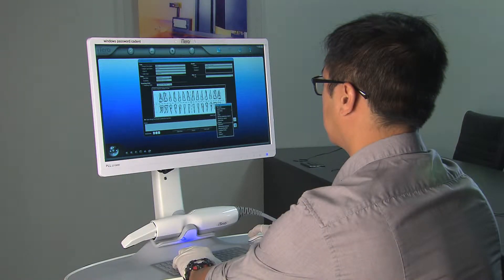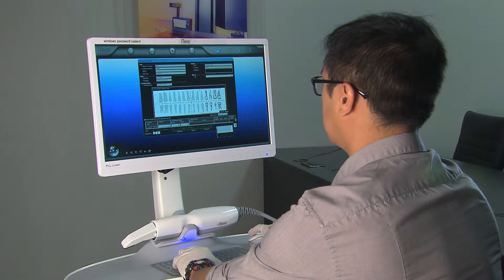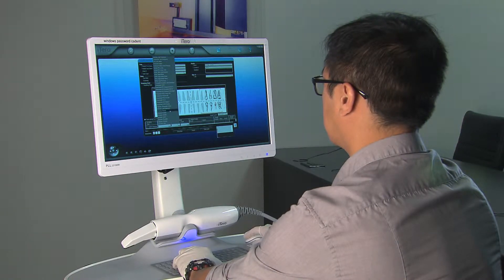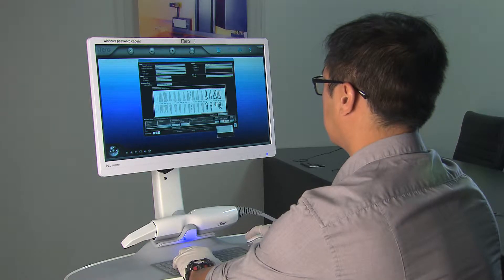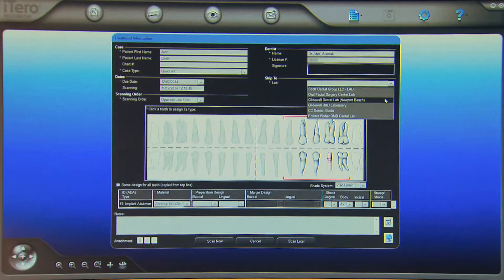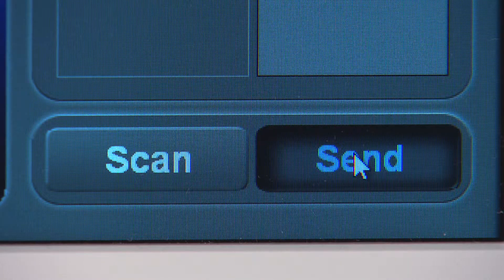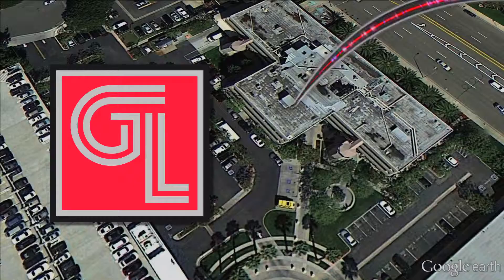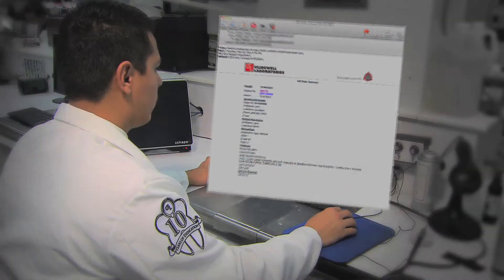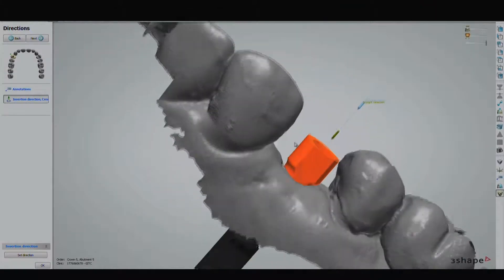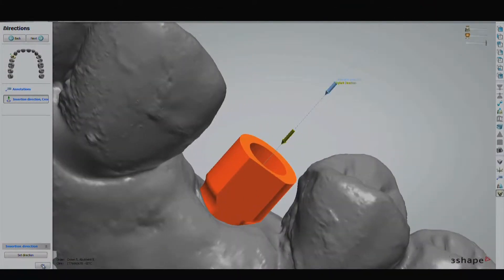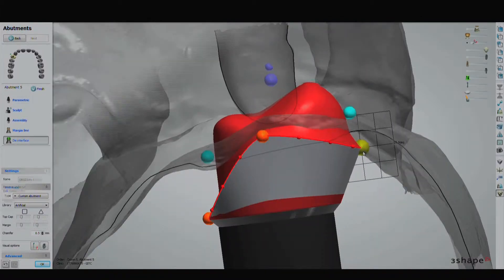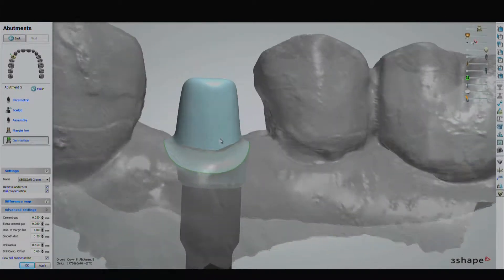The software for most intraoral scanning systems is quite straightforward. Once the scan is complete and the doctor is happy with the result, sending the necessary digital files is as easy as selecting the desired laboratory from a list of providers and pressing send. Glidewell Laboratories can work with any system that can output in the standardized STL file format, meaning any clinician who adopts an open scanning system can take advantage of the significant discount the laboratory offers for restorations produced from digital submissions.